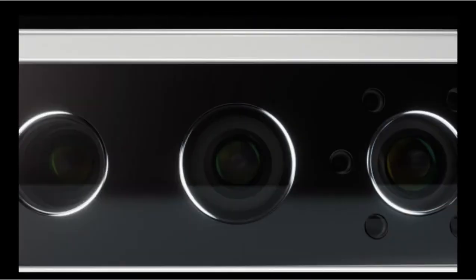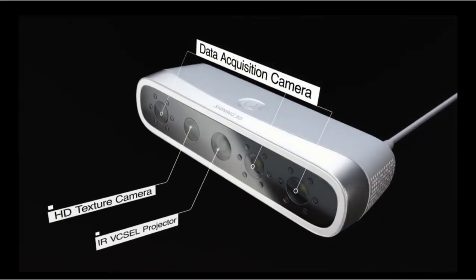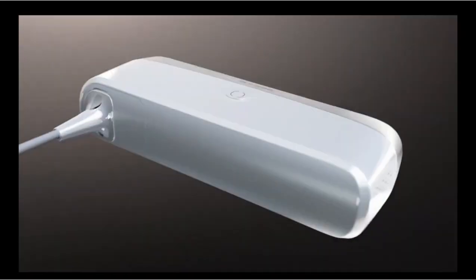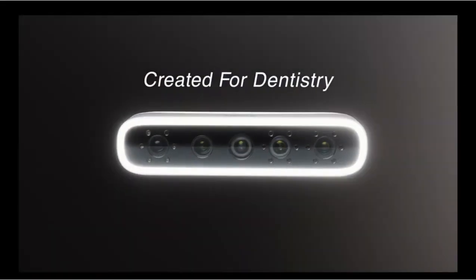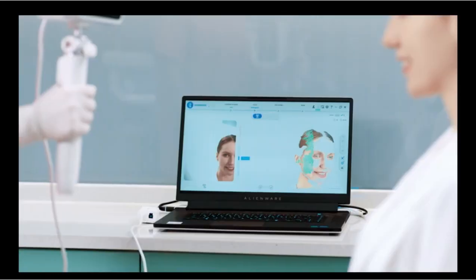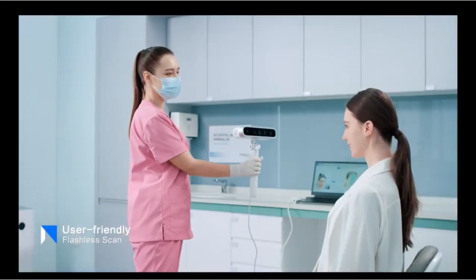Face scanning can accomplish the face bow function in a perfect way. By aligning the face scanning to the intraoral scanning, you can easily align the maxillary arch to the horizontal plane, as we see in the video.